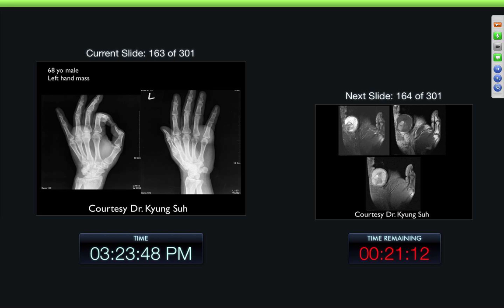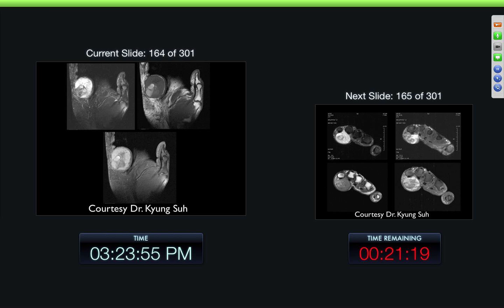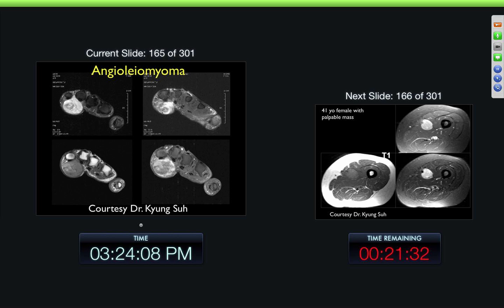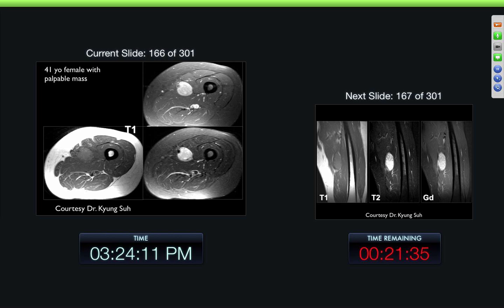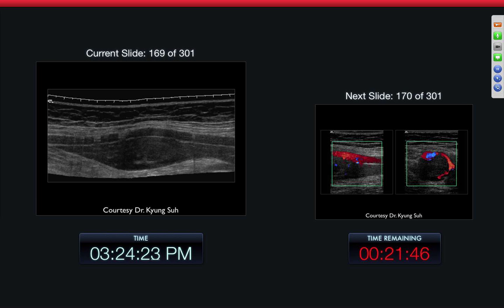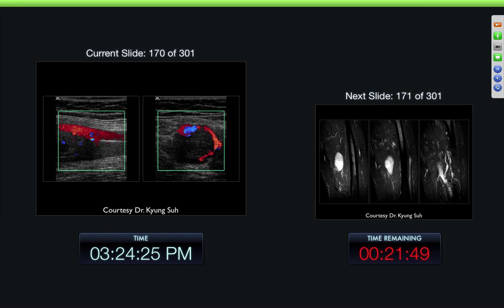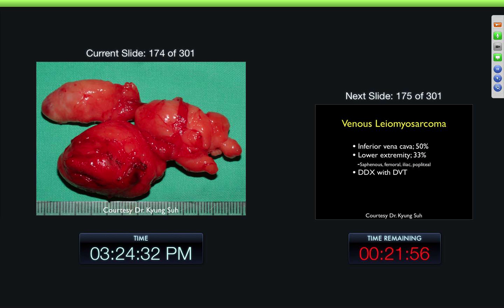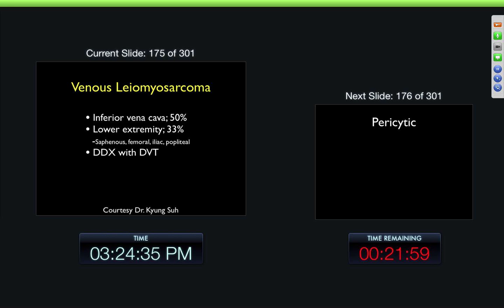68-year-old male, left-hand mass projecting over the fourth and fifth metacarpophalangeal joints. Here's the lesion on an MR examination — very inhomogeneous in its characteristics. This is angioleiomyoma. 41-year-old female with palpable mass — we can see the mass very nicely. It looks like it's adjacent to a vessel and some of the septa, kind of a lentiform shape. Vascularity around the mass, looks like maybe some draining vessels. That's what it looked like in gross. And this was a venous leiomyosarcoma.